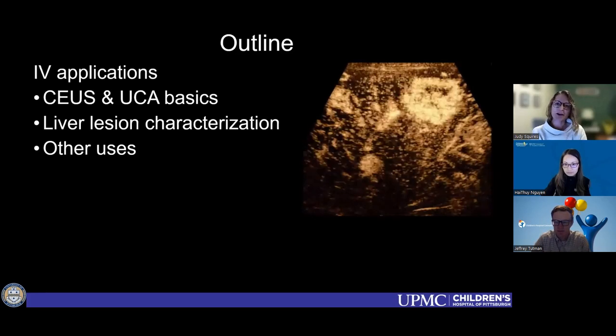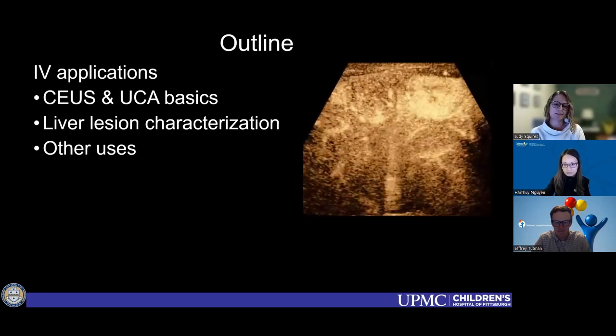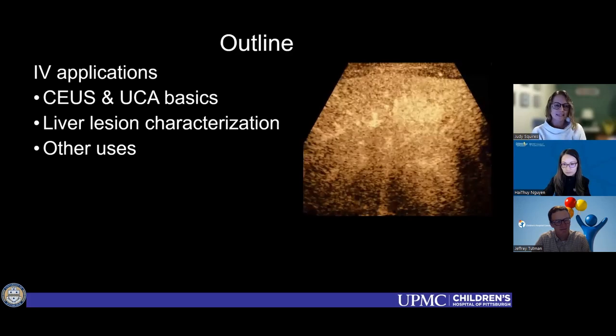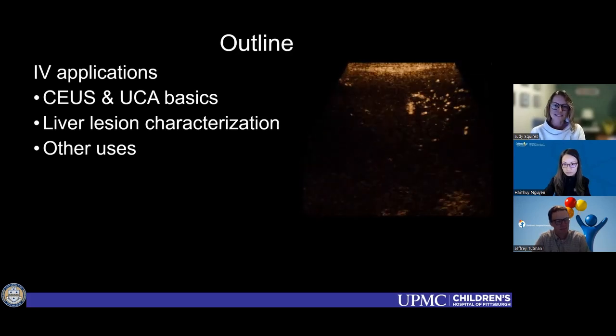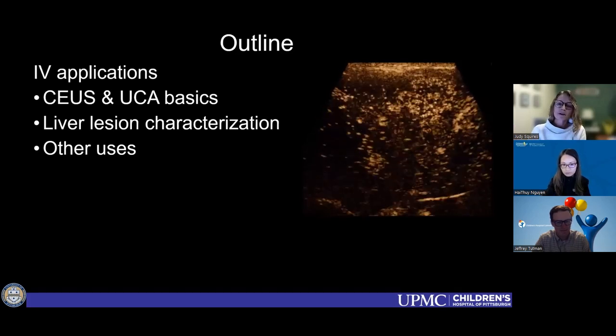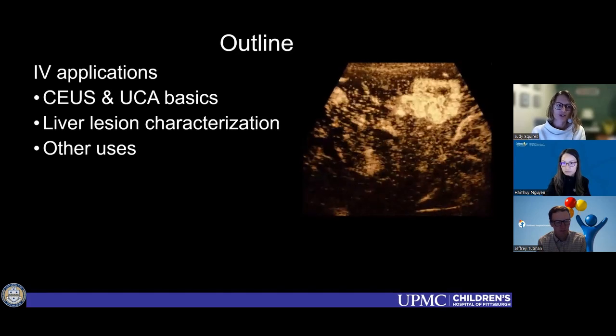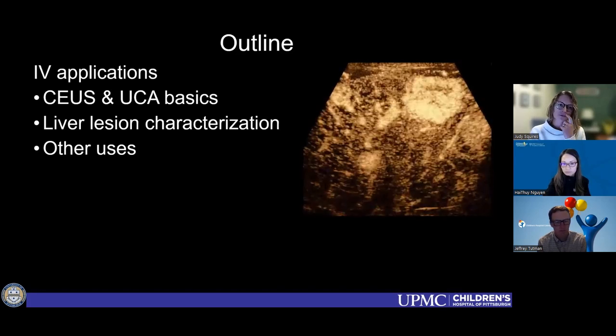I find the other applications, where you just inject it into a cavity and see where it goes, less fun and interesting. So, IV indications. We'll talk about ultrasound contrast agents and basics of contrast enhanced ultrasound. We're going to focus a lot on liver lesion characterization because that's the most common IV application, and then we'll spend a little bit of time on other uses.